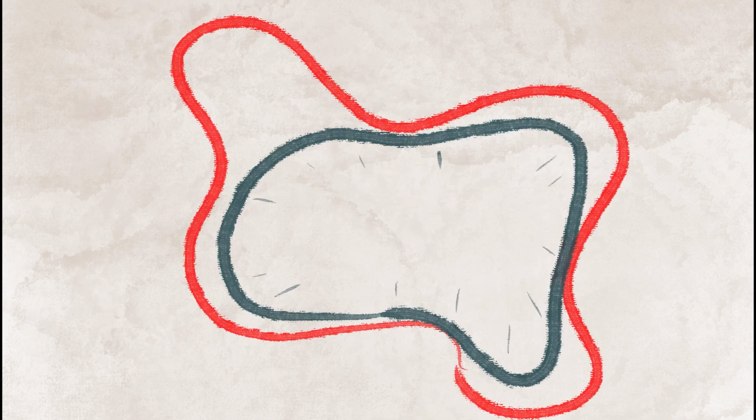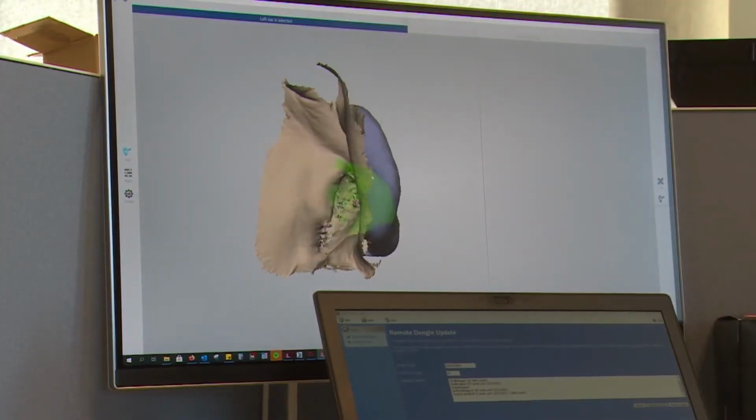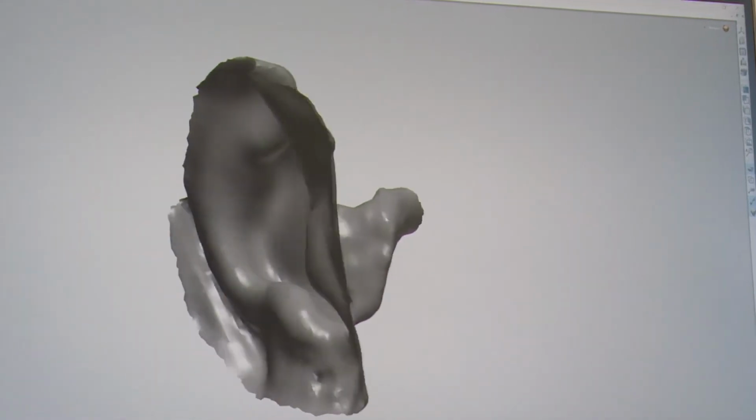Our method of simulating the inside volume of an irregular shape is to blow a balloon in it. The formed shape gets into all the cavities of the ear canal. This project was created for Dopple, who provided us with 500 ear scans where we could make the simulations for.